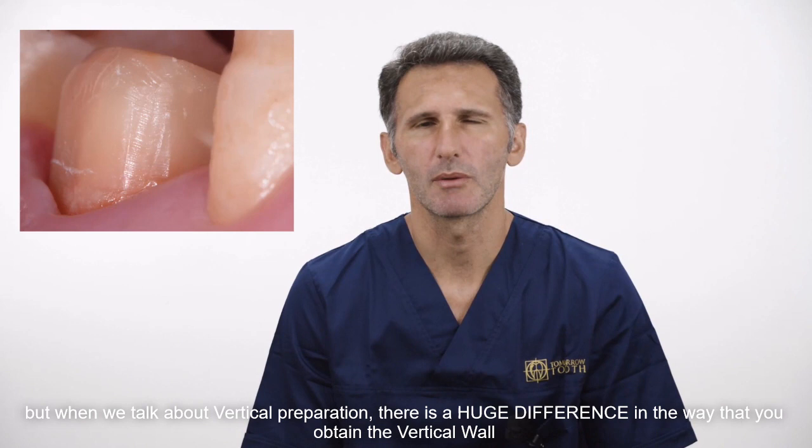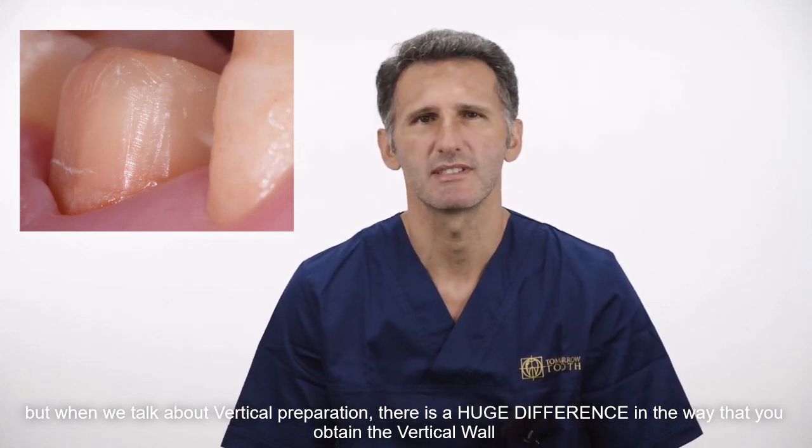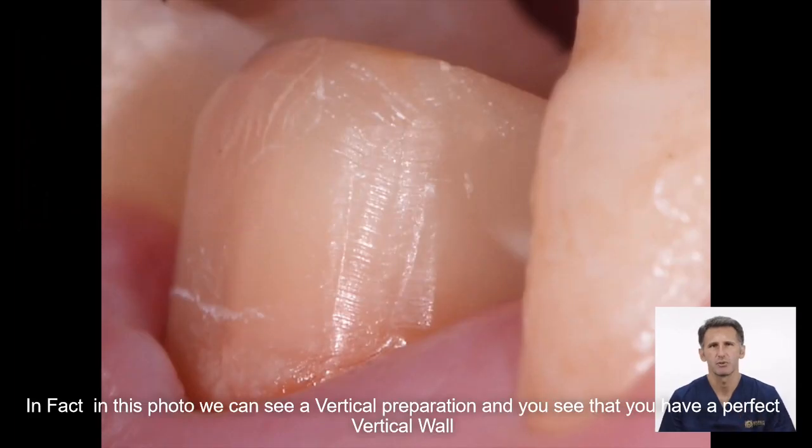But when we talk about vertical preparation, there is a huge difference in the way that you obtain a vertical wall. In fact, in this photo we can see a vertical preparation, and you can see that we have a perfect vertical wall.